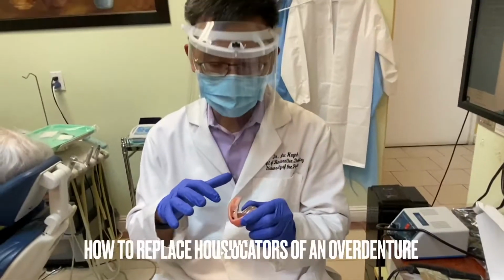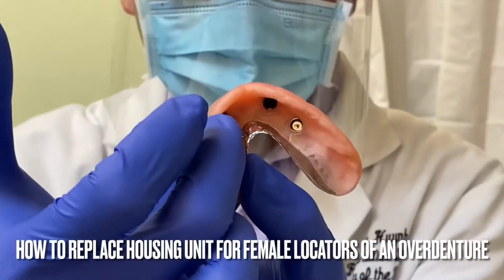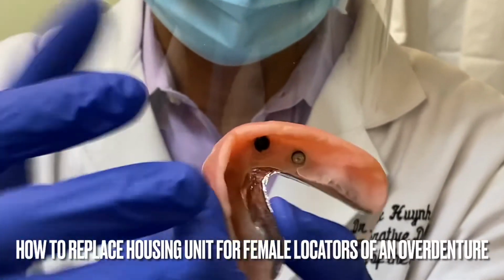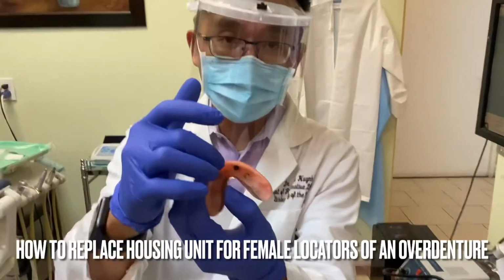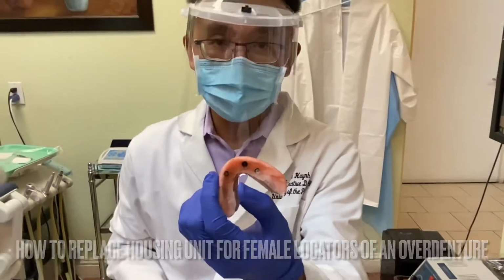We're going to show you how to replace the missing locator of an overdenture. So basically every 6 months, every year, sometimes patients come in missing these, that we're going to have to replace them for him. Very simple.